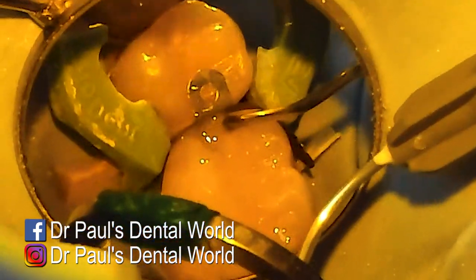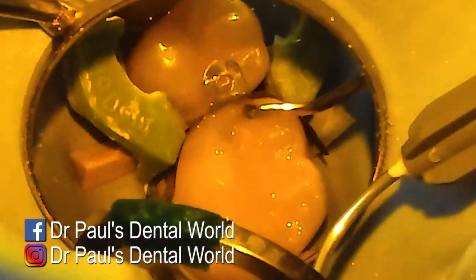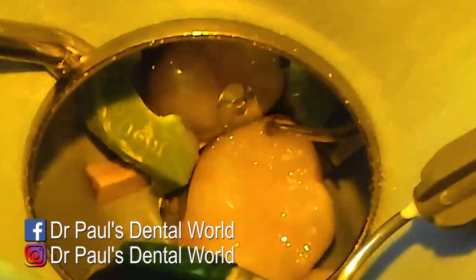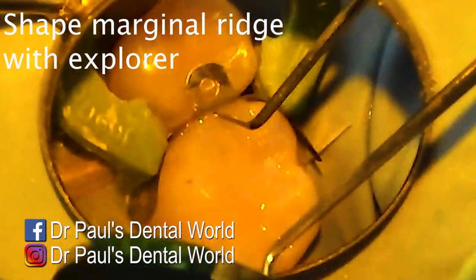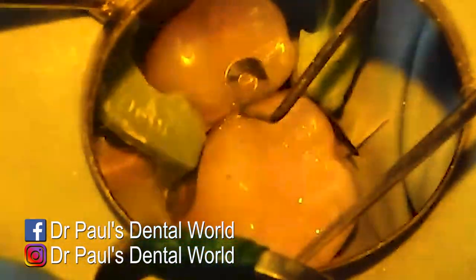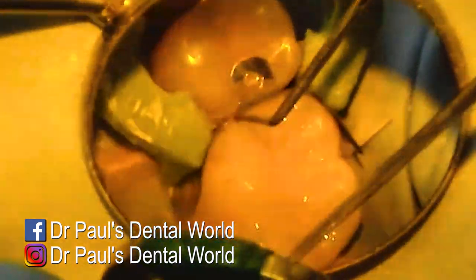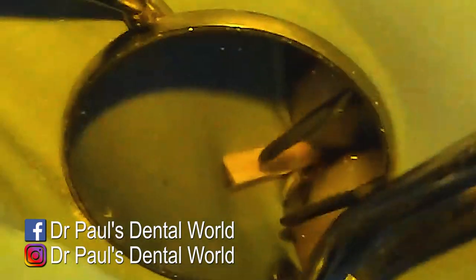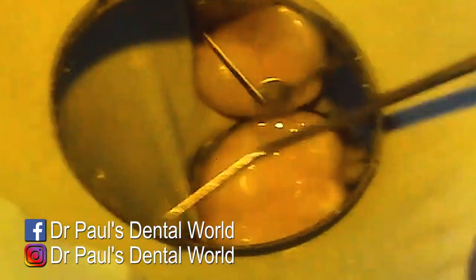I'll show you the parts where I place the increments, knowing that each time I am using my explorer and curing it. For the final increment on the front section of the tooth, I'll use my explorer to shape the marginal ridge slightly, because if I can shape it here it'll save me time afterwards — it's a little bit easier to do this here rather than with a burr.